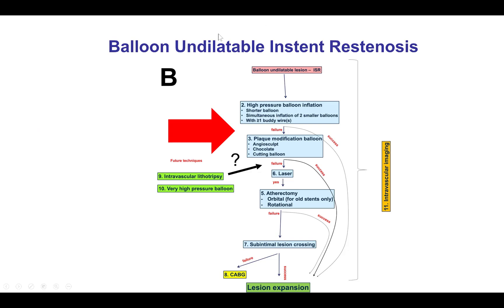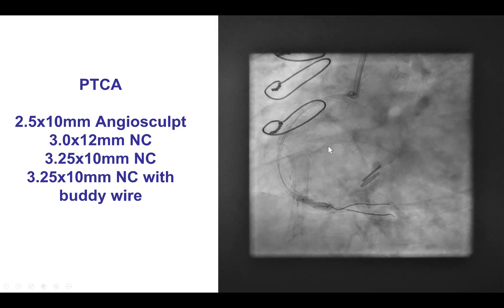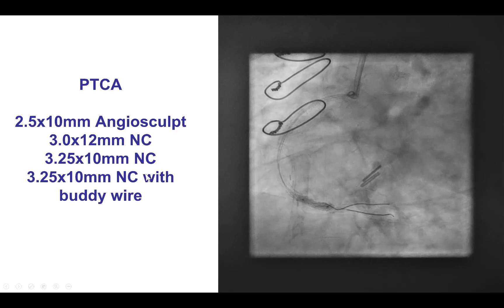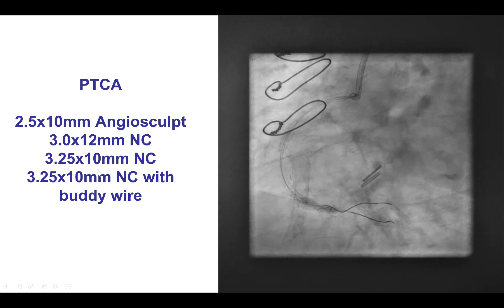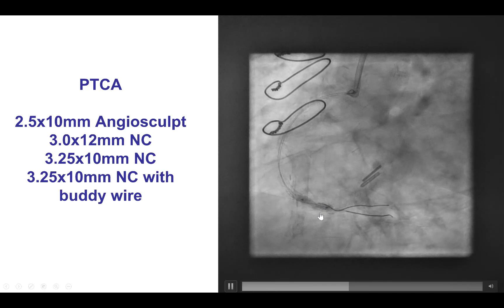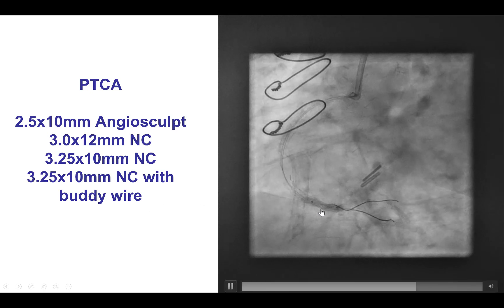How to treat a balloon undilatable in-stent lesion? The first step is to use high-pressure balloons and plaque modification balloons. This is exactly what we did — several non-compliant balloons. We used the AngioSculpt as well as non-compliant balloons with the buddy wire. We can see the waist in the balloon.